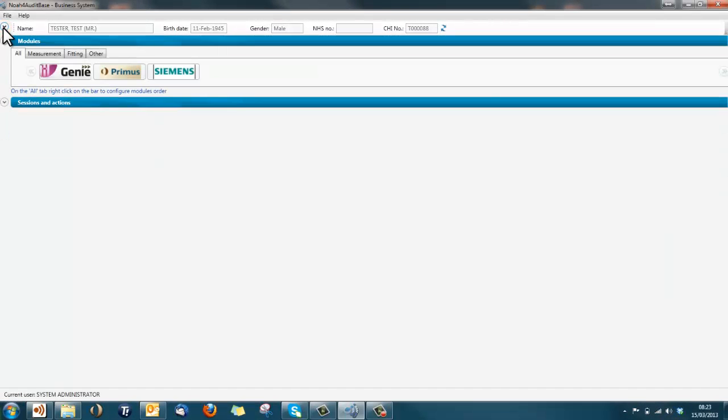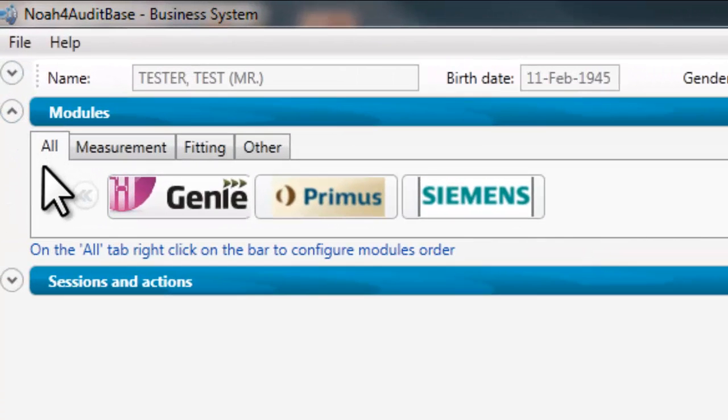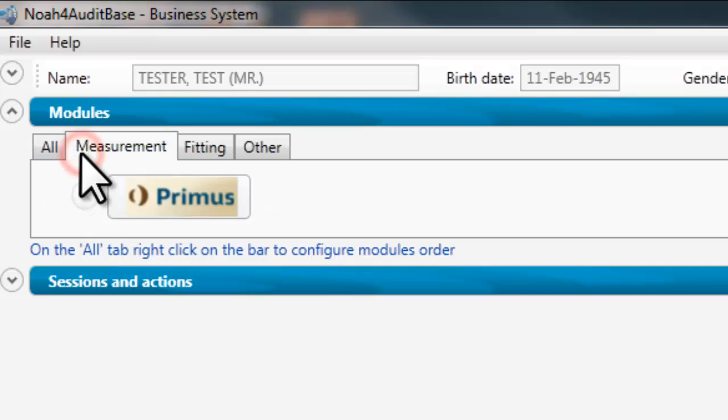Moving into the modules area, modules can now be viewed in categories. Clicking the all tab will display all available NOAA modules. Measurement shows just those modules relating to measurement.